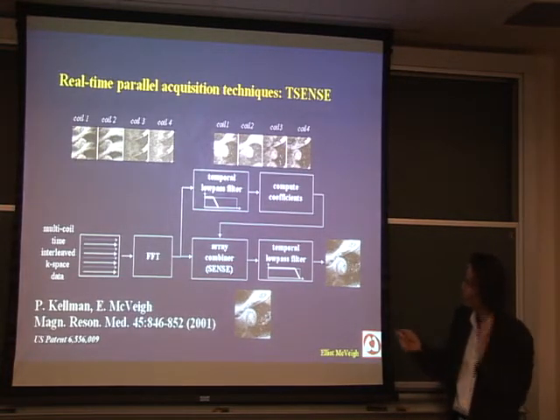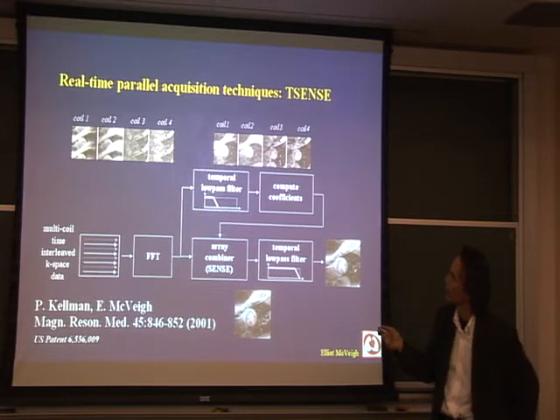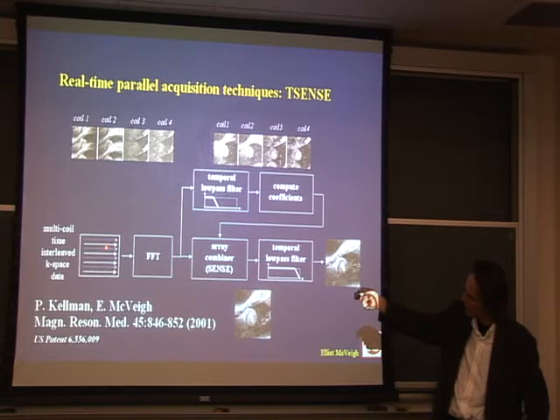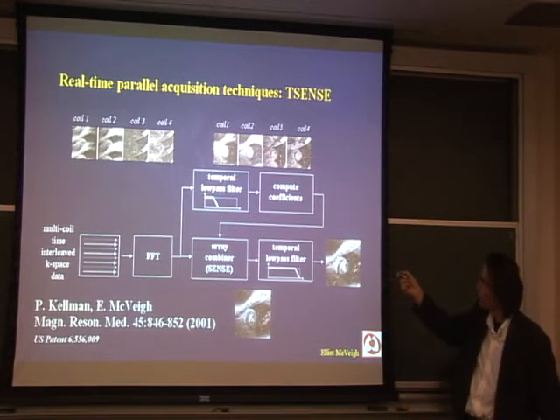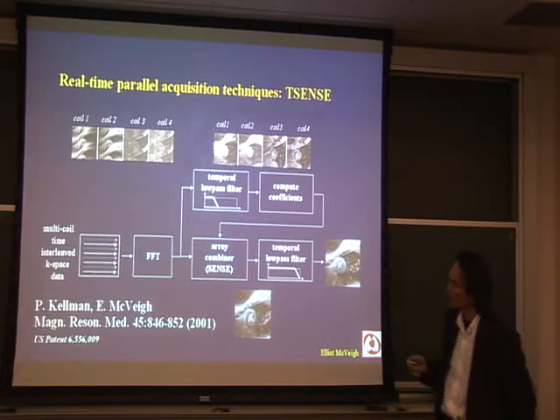The way we do it is we get those coil maps, or the images of the coil sensitivity, from the many coils that we have, by doing what's called jittering this data. We take every other line, say, but in time we jitter this up and down. And what that does is it makes the artifact flicker. So if this flickers, we can then filter that out with a temporal filter. And what we get is a set of images in which the artifacts are gone, flickering. These are temporally blurred, these pictures, so they have no artifact. But we can get the coil sensitivity for each one of these pictures and feed that back to the phased array combiner and get the final image.